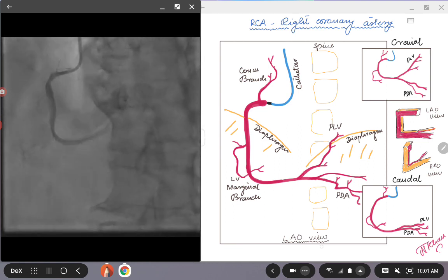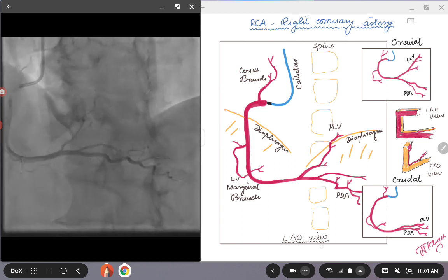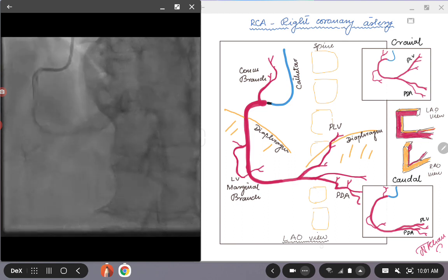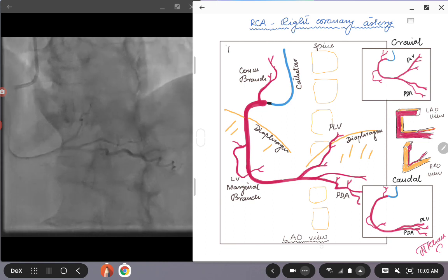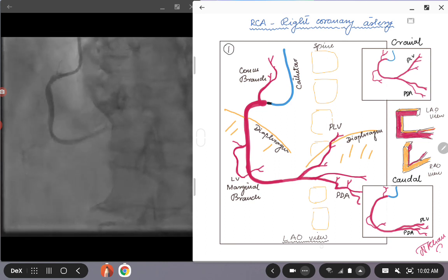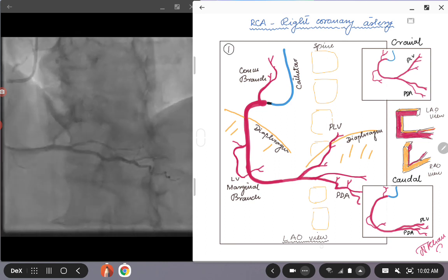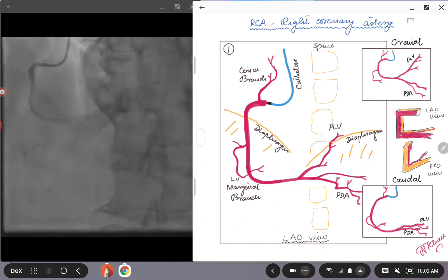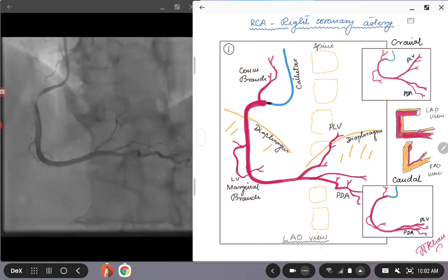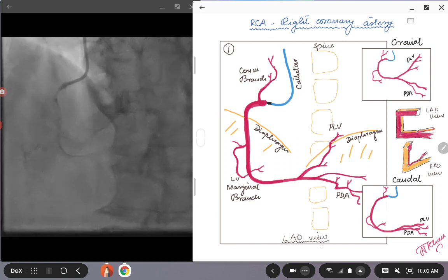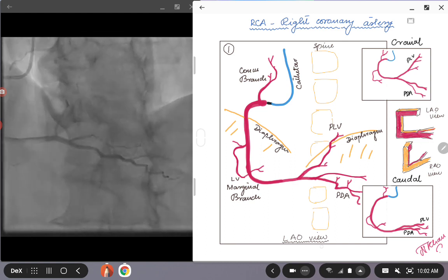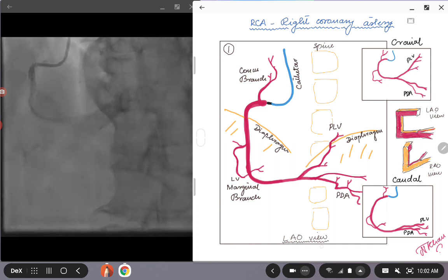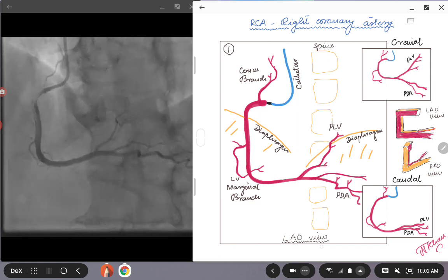Today we're going to be looking at the LAO view for the right coronary artery. If you look at picture one here, I have shown a diagram for the right coronary artery, and on the left of the screen you can see a live angiographic cine loop for a patient who is undergoing a coronary angiogram in the right coronary artery.